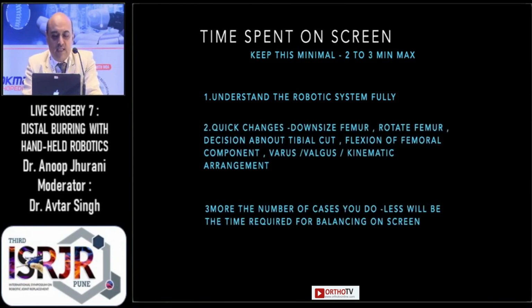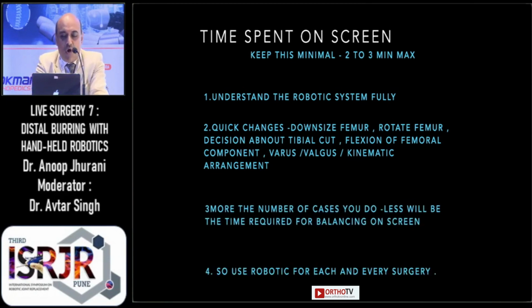More the number of cases you do, less will be the time required for balancing on the screen. And that's why use your system regularly for all cases, each and every case, use robotic system, don't keep it only for your difficult surgeries.